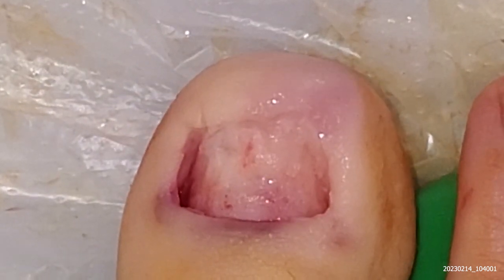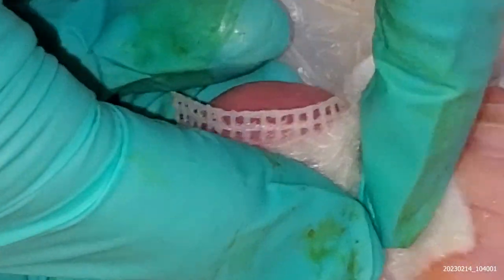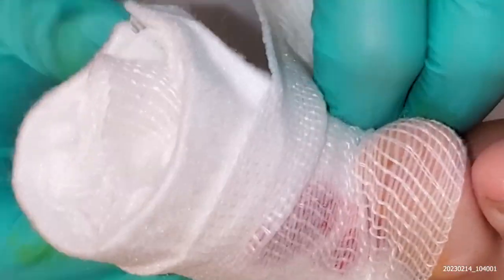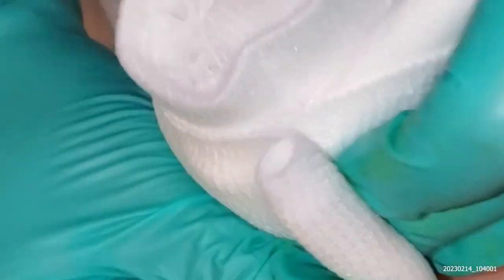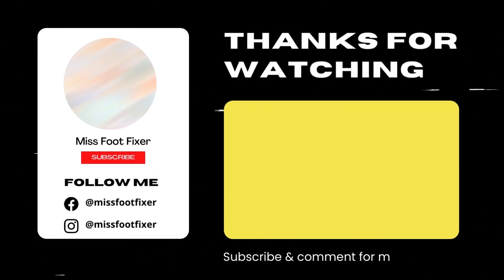Amazing. The bleeding has turned — good, excellent. We're just going to dress that. We probably need a bit more dressing — maybe another gauze or even that tissue over there. We'll see how it goes.